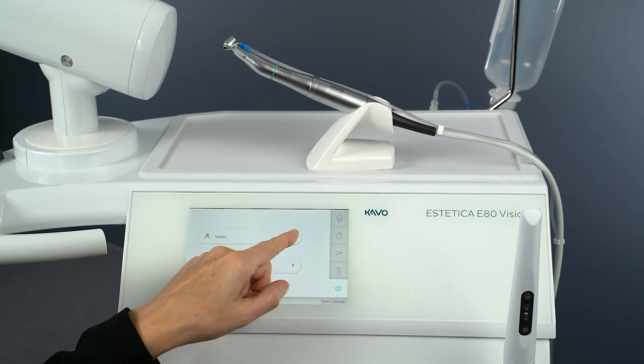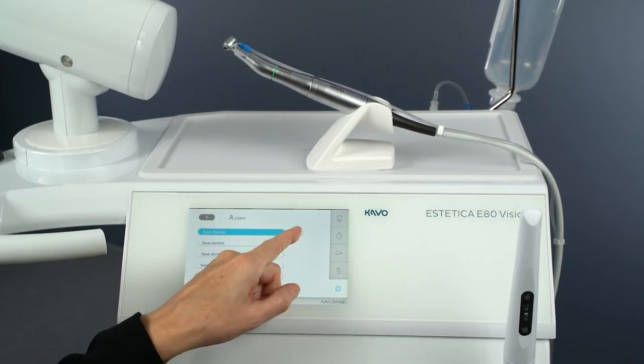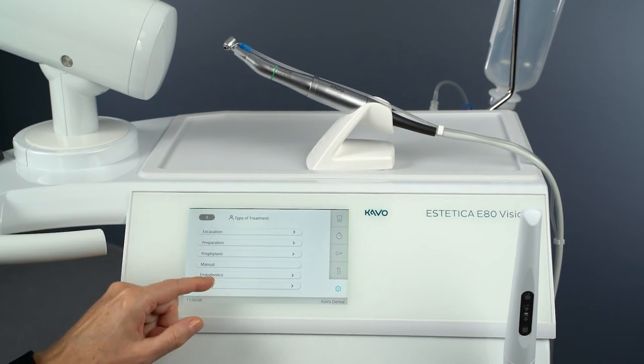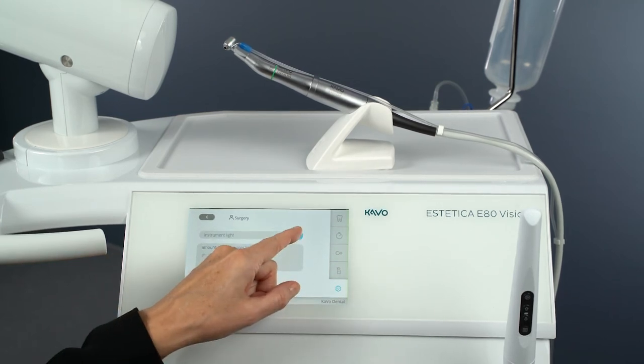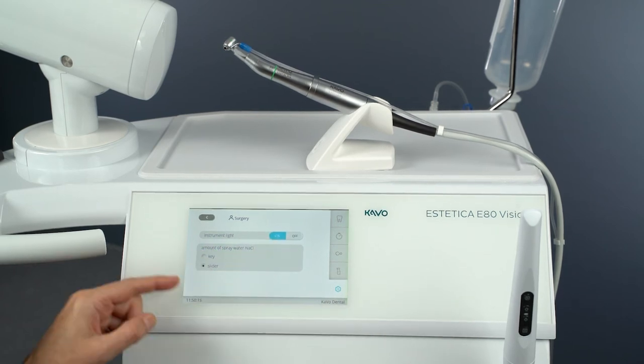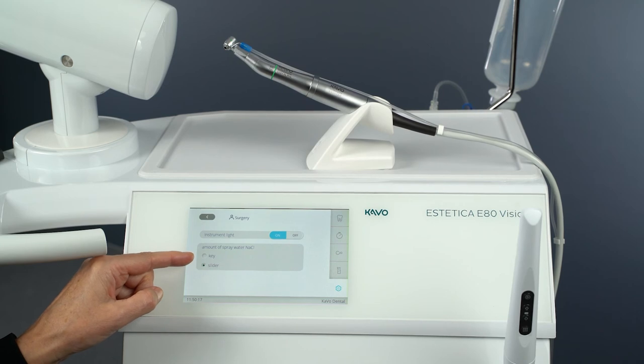Tap the Settings tab and select the user and the desired practitioner. Select Treatment Type Surgery from the list. Tap Instrument Light to turn the instrument light on or off.